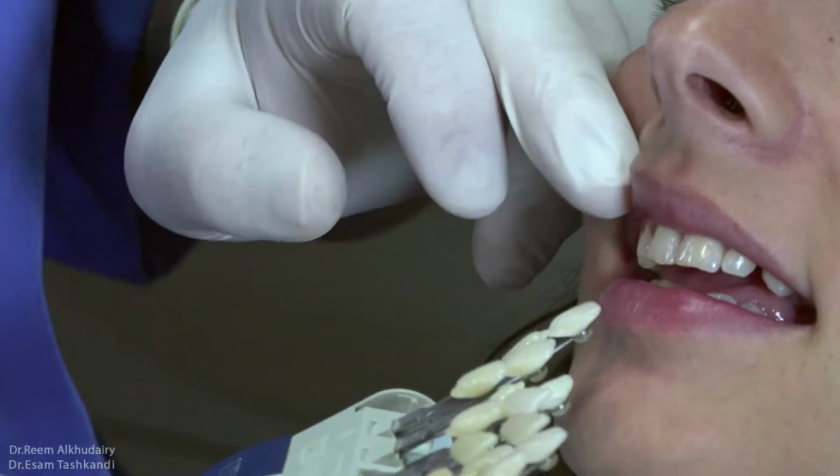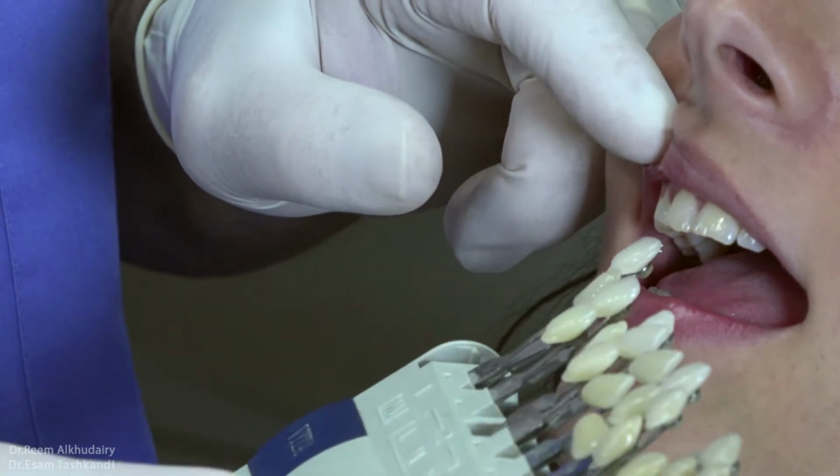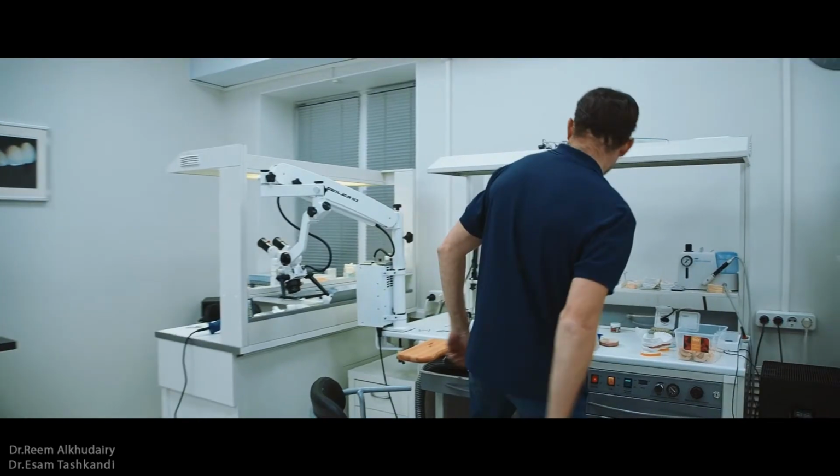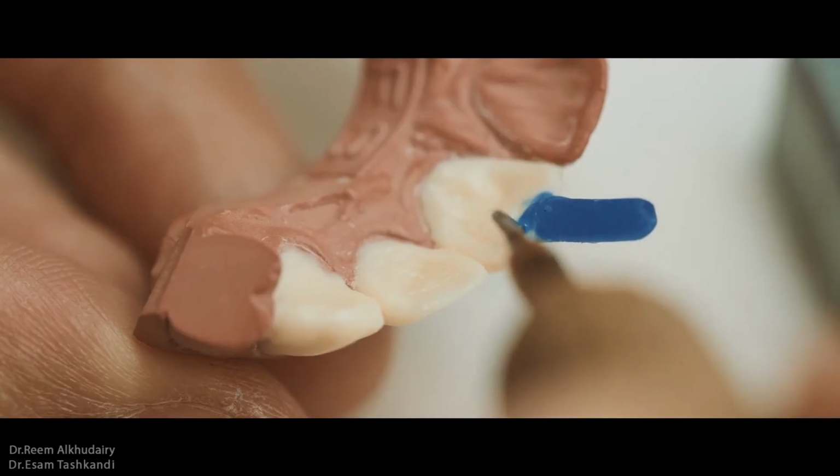There are two crucial steps for creating a natural-looking restoration: the selection of the shade in the operatory and the duplication of the selected shade in the laboratory. Although these steps may seem simple, it is extremely difficult to assess the shade of a tooth.